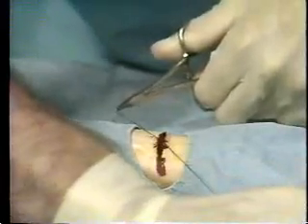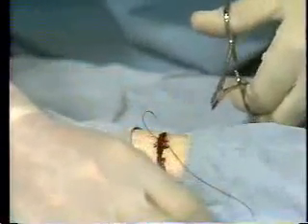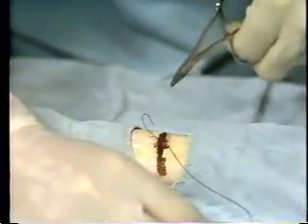The finished stitch should slightly pucker the skin so that after edema subsides and the skin is slightly stretched, the stitch will hold the skin firmly but without puckers. Do not tie the knot directly over the wound.